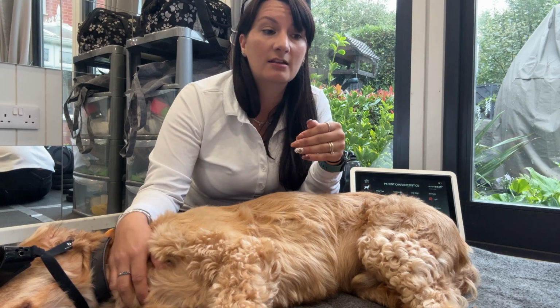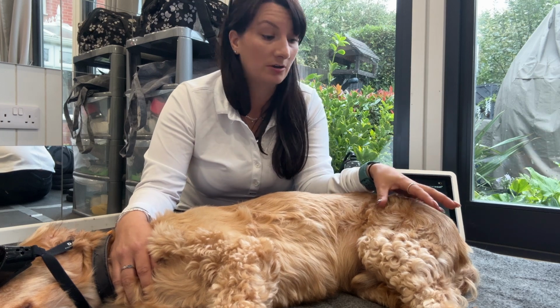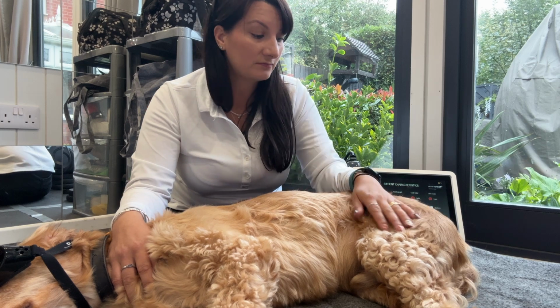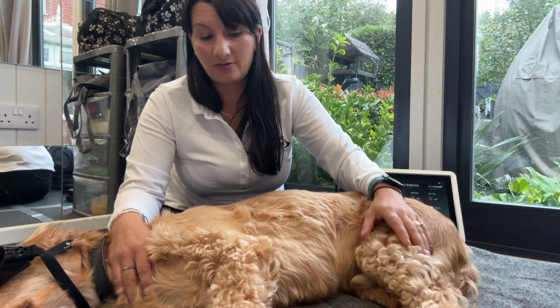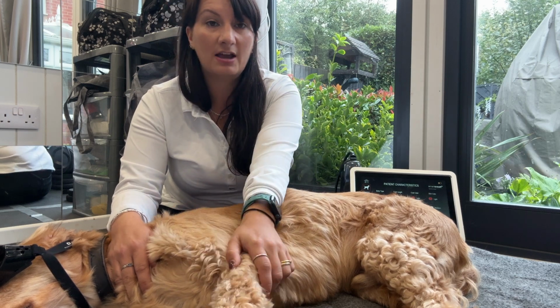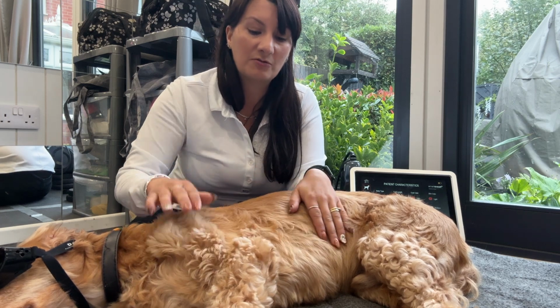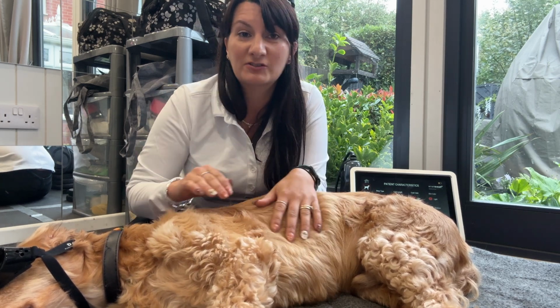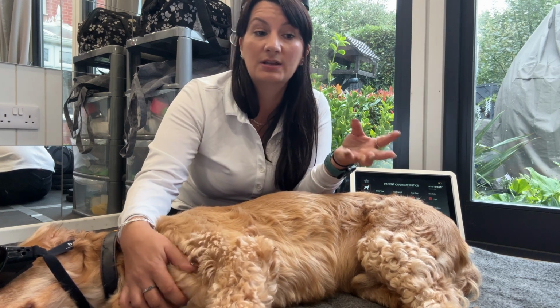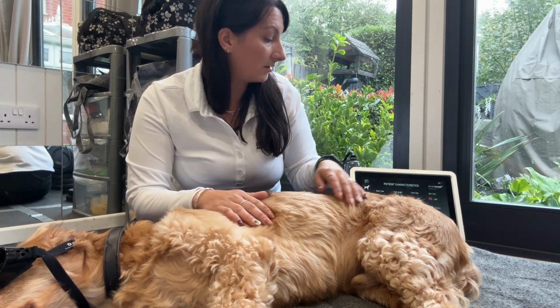It's just ensuring that if we are calculating our own, are we taking into effect the entire picture? If I'm treating this hip, where maybe I've got a bit of muscle coverage there but not so much fat, versus abdominal, versus shoulder, elbow, have we taken into consideration all those elements? And if we have an animal that's patchwork, so maybe a Dalmatian, for example, we've got darker patches there, so we need to take into account what wavelengths we're using, and what wattage particularly we're using on those as well.